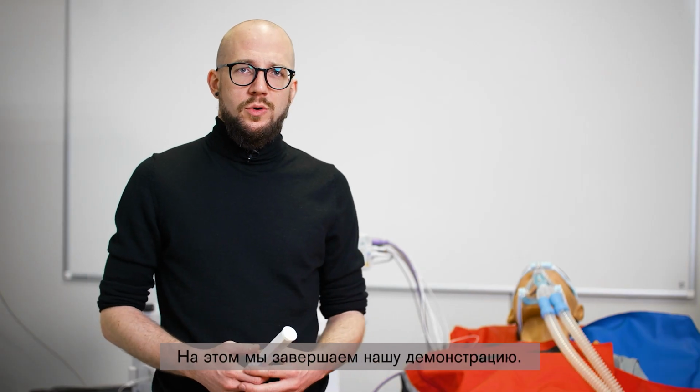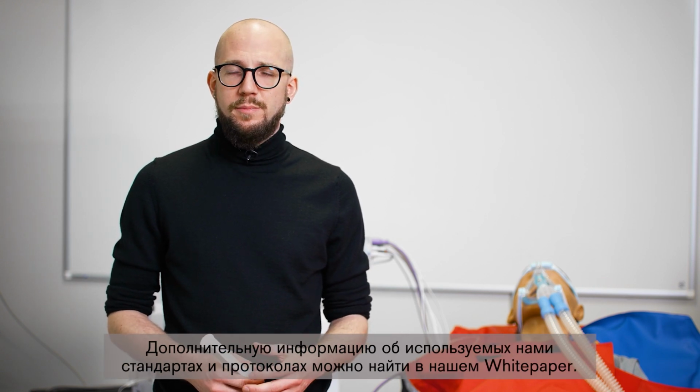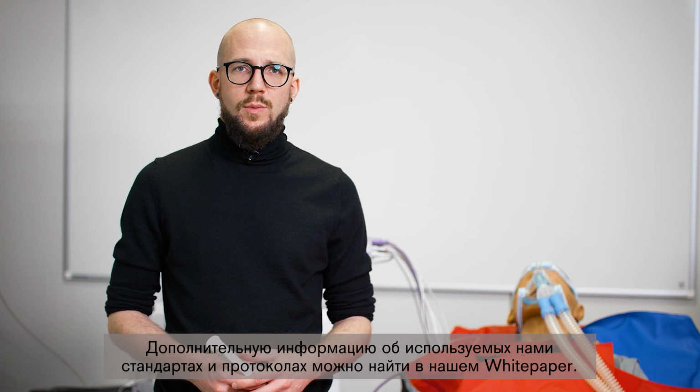At this point, our showroom will end. I hope you enjoyed what you just saw, and thank you all for watching. For further information about the standards and protocols we used, please read our white paper.